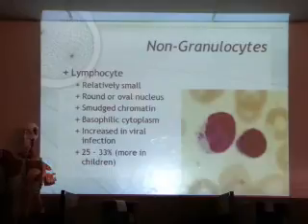But generally speaking, lymphocytes should have round or oval nuclei. They never have lobulated nuclei. They don't have convoluted, twisted nuclei. They should not even have creases in the nucleus. No folding, no creases, no indentations, no deep indentations in nuclei. In fact, creases and deep indentations in the nuclei of a lymphocyte are considered very abnormal. We may be looking at leukemia or lymphoma, so that's one of those clues. So normally a round or oval nucleus.